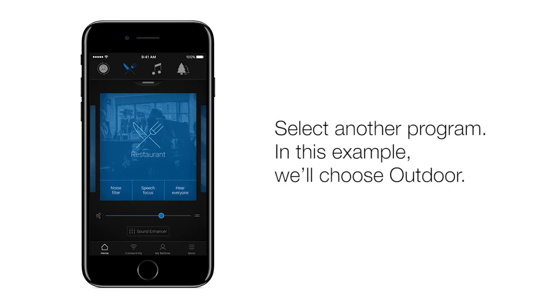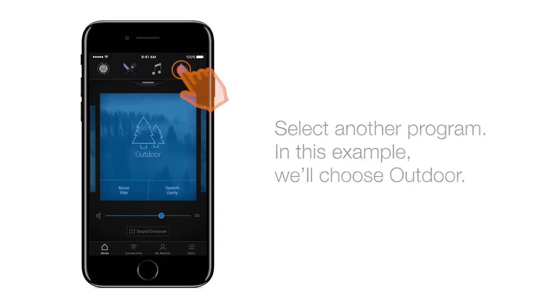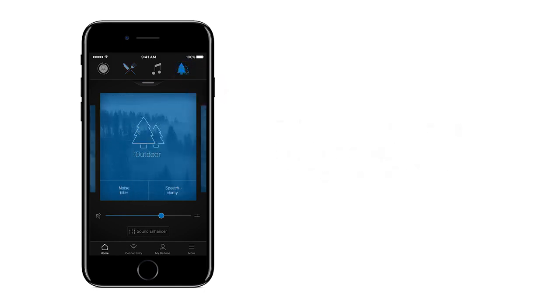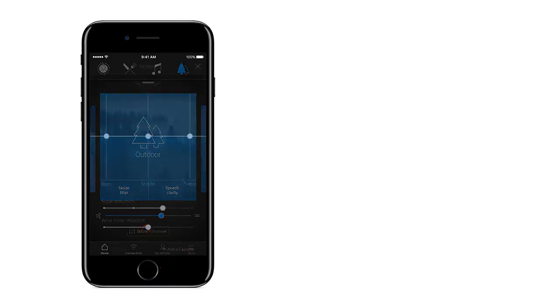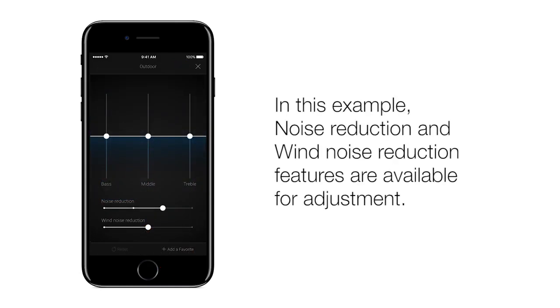Select another program. In this example, we'll choose Outdoor. Tap Sound Enhancer — the button on the bottom just above the bottom menu. In this example, noise reduction and wind noise reduction features are available for adjustment.